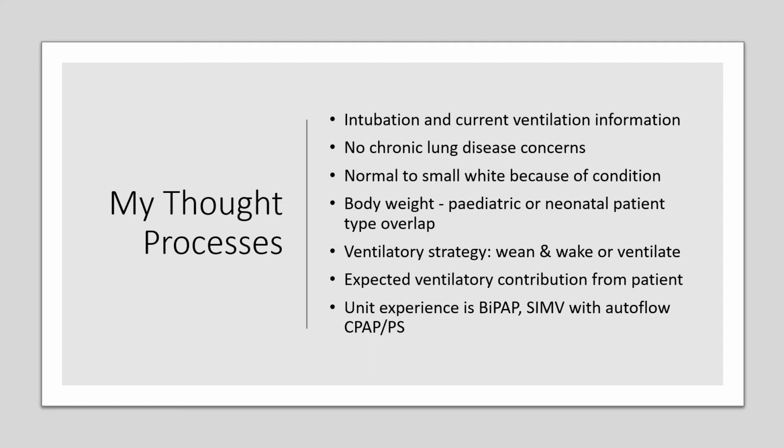But for the people looking after the patient, the NeoFlow sensor can be a bit temperamental. It can get on your nerves and it can make the ventilator alarm a fair bit. So therefore, some of the staff looking after the baby necessarily won't like it. So you've got those pros and cons to examine. Then you've got to decide on what ventilatory strategy you're going to use.